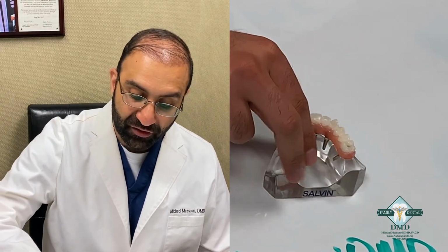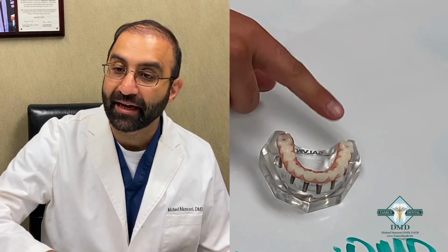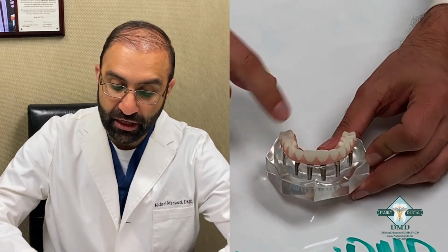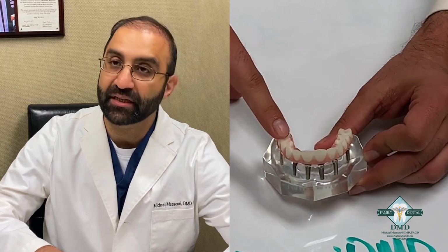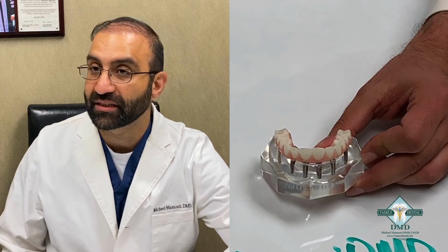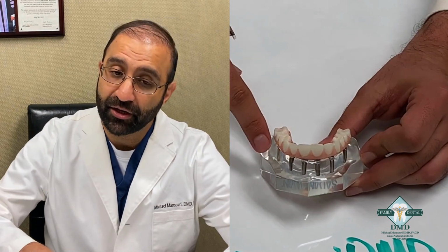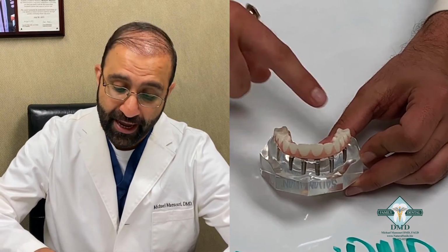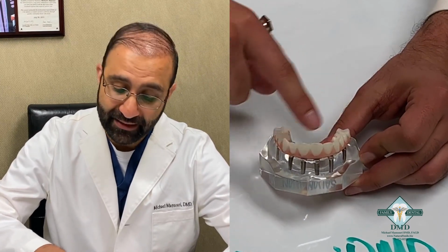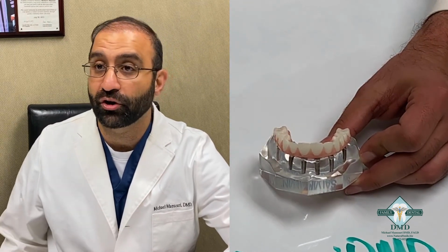Most of the patients, after 6 months of having this process placed, will come back and have a permanent set of teeth placed. Which means, initially after surgery, you go home with a temporary set of teeth. This temporary set of teeth will be what you'll have for the next probably 4 to 6 months. During that time, the gums will heal around that area. Your bone's going to get stronger and everything's going to shrink a little bit around it. So that's when we're going to replace it and put a permanent set of teeth in place so you can start to function and it'll start looking even better.